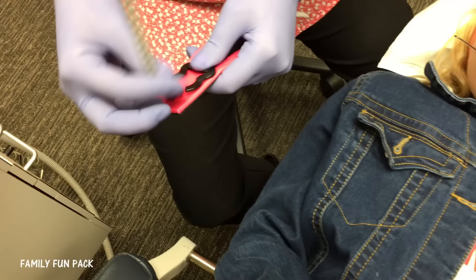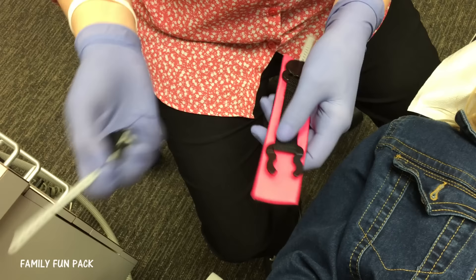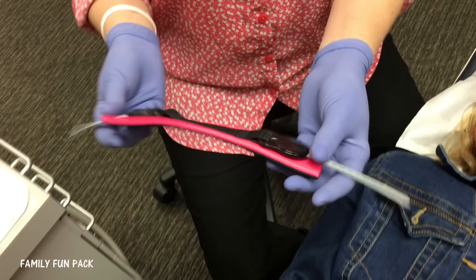The next strap — this part is what's going to do it. Do you like it? Or is it silly? I don't know — she's not sure yet. So you just pull and then pop that off like that. Oh, cool. Yeah. So you just slide it back in when you move it and pop it right back in.